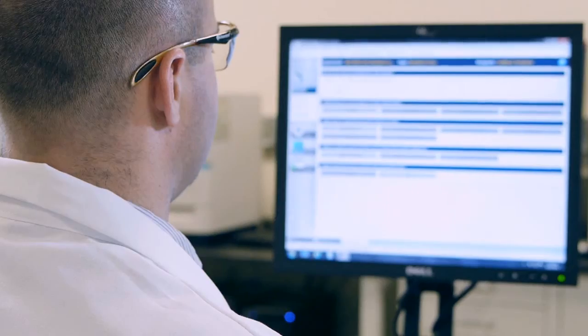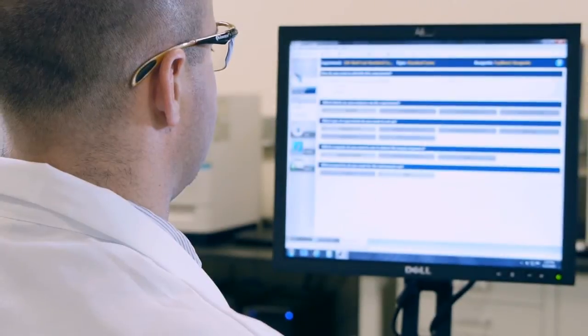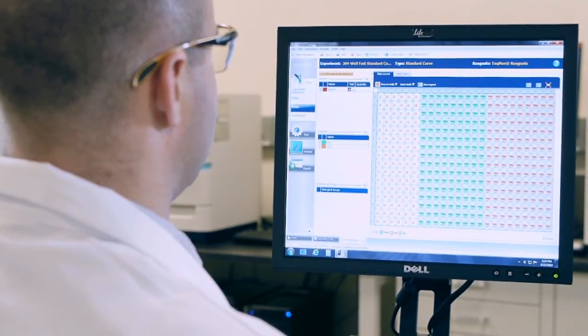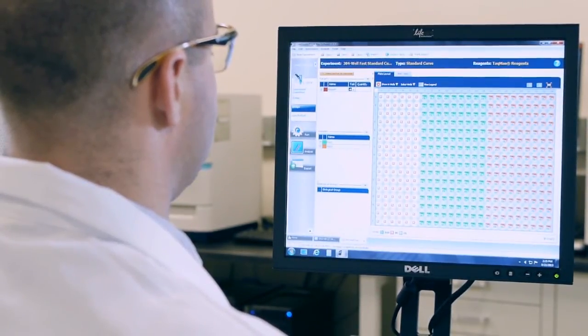Once the run is finished, results can be delivered to a laboratory information system, helping reduce the workload for busy technologists.